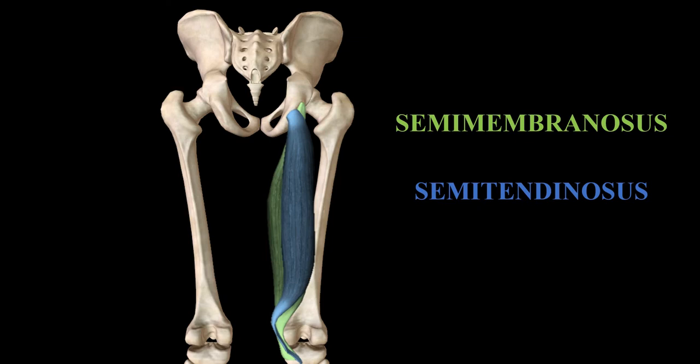which is why with EMG analysis you'll often see researchers play it safe and say, well, medial hamstrings and lateral hamstrings. So medial hamstrings just referring to the membranosus and tendinosus together. We won't say with any degree of certainty how much activity each individual muscle is contributing. We'll just group them together as one.